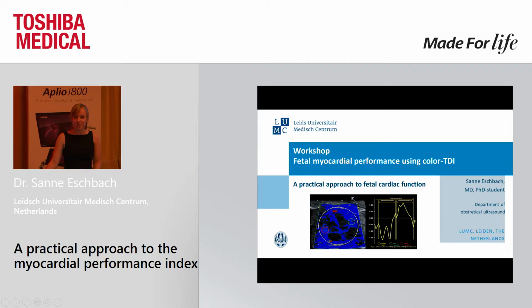I really enjoy being here and explaining more about the color TDI and the technique and the approach that we use. It's called a practical approach, so I'm going to try to make it as practical as possible, but first I really want to start by explaining the theory behind what we are doing.